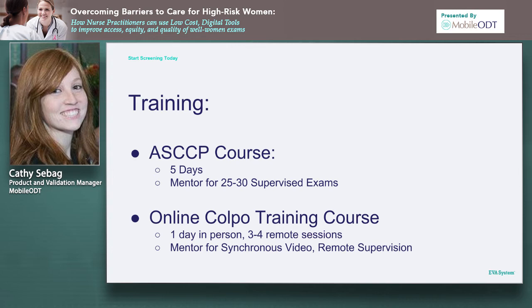And Mobile ODT is just a technology provider to make it easy for you to do that live session and that live video portion for the mentorship. But again, the content and all parts of the clinical portion are led by experts in the colposcopy field today. One note on this, it's really important that you check with your state regulations, as some require additional documentation and mentorship components as you undergo the training.